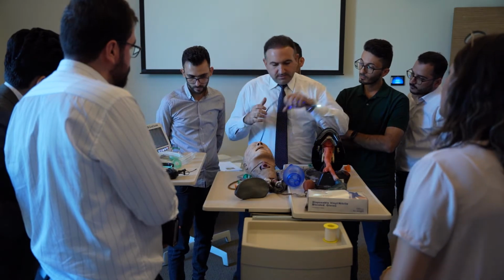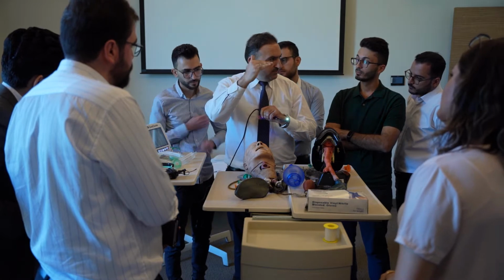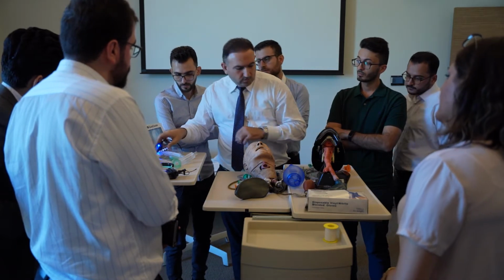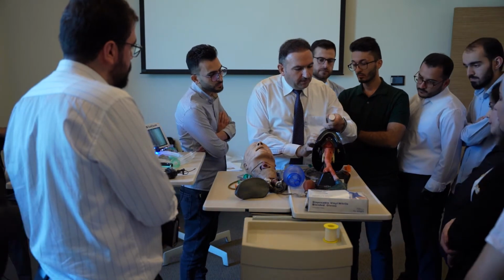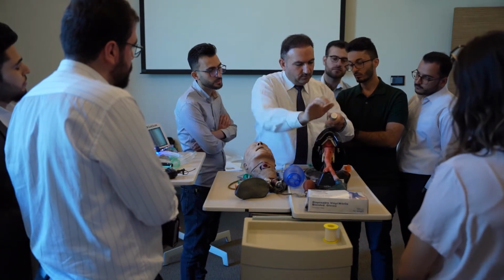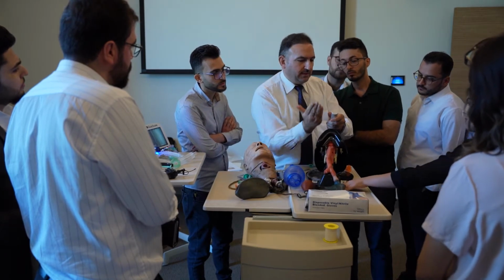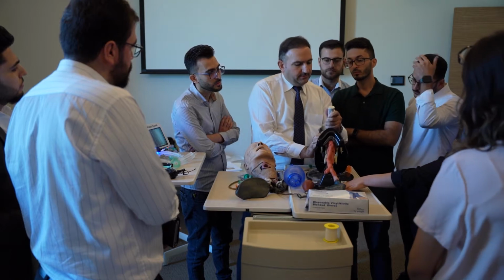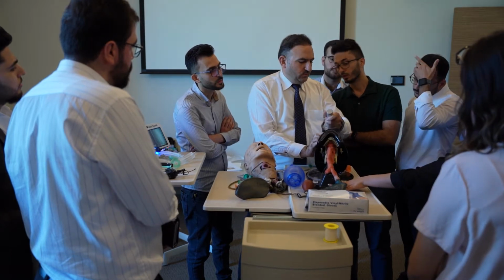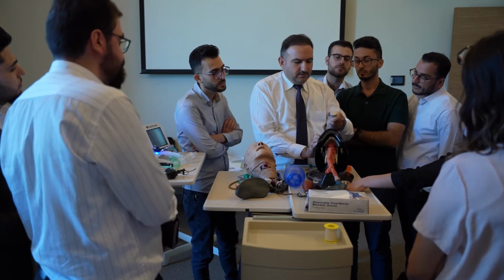So this is the anatomy. It goes just above the epiglottis. How to put the laryngoscope? 45 degrees, up and forward. Up and forward, so 45 degrees like that. Not straight like that, because the pressure is on the teeth, the upper teeth, and you will break them.